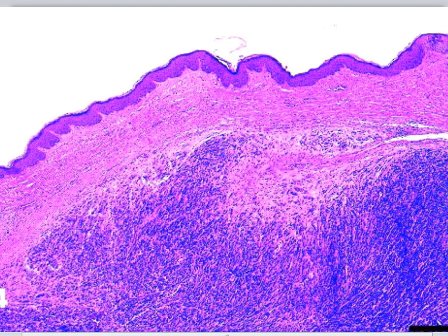In a section from the skin, which you see here, this being the epidermis and this being the dermis, you can see the tumor cells, the dark blue cells, infiltrate quite diffusely, reminiscent of a lot of lymphomas. And you can see that there is basically a very streaming pattern of growth, like it was to be expected clinically, that these are very fast growing tumors, which is why they have decimated much of the populations of the Tasmanian devils in eastern Tasmania.